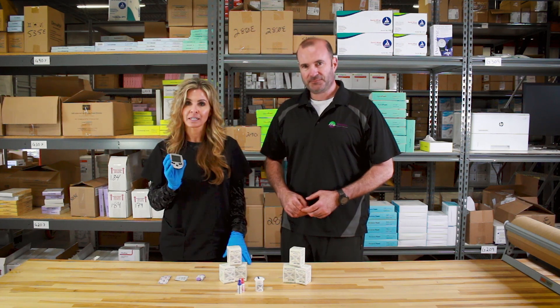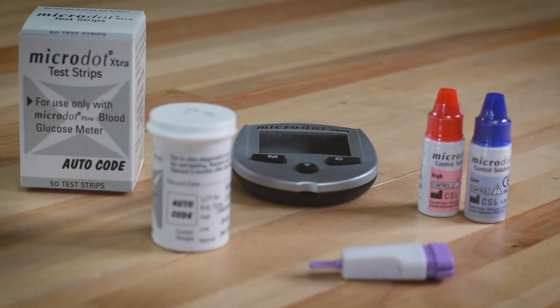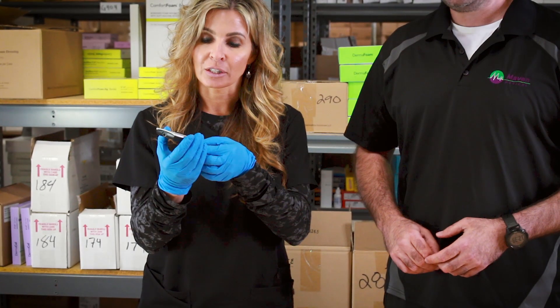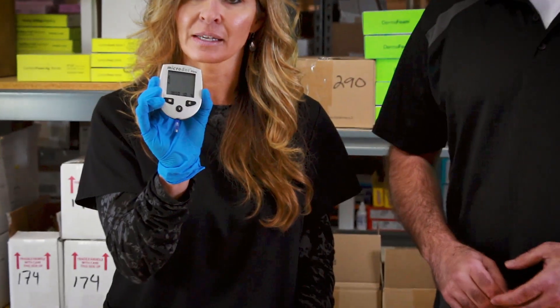We're going to show you the strips and we are going to take Dave's blood sample and see how he does here. This is their no-code meter — it's fast, it's simple, it's easy to use. It actually gets started by just putting the strip in, and then it recognizes that it's there.